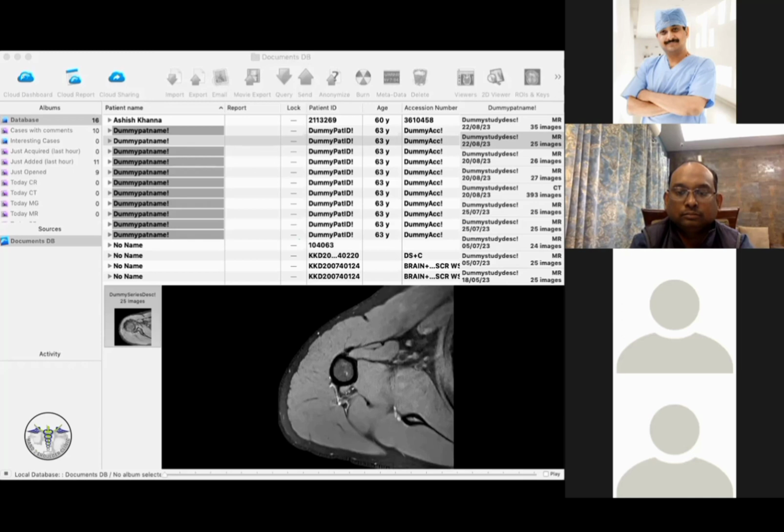Before that, I'll put in 10 minutes just to make you aware of arthroscopy, what we see and how we look at things from a different perspective. That will be interesting, for orientation, like we can correlate one or two cases, MRI and then the arthroscopy. It is like seeing that live thing.